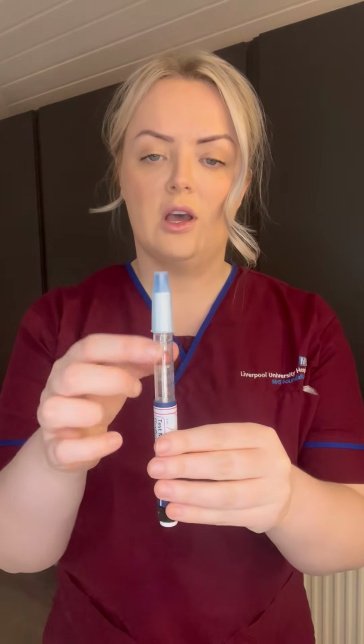So what I would want to do is apply the needle. So if I just come closer, you peel off the lid and you just screw it on to the end of the pen as such. So you can see that's now attached, and what I want to do is remove this clear cap. Now you can see that the needle is not exposed at that point, it's completely covered up, but you can see it through the blue cap.